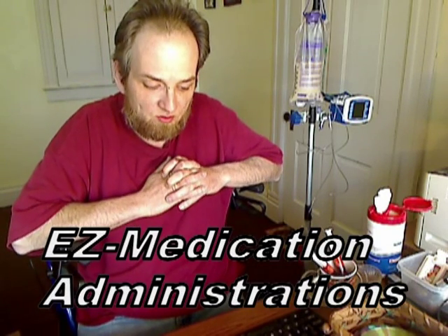Okay, everyone, I wanted to show you some feeding tube tips with medication. Of course, I can't swallow my medication, so all my medications are either liquid or they get crushed and turned into a liquid. I will show you in another video a neat way to crush your own medicines. If you take several, like I do, you can crush them in a coffee bean grinder, and it turns it into a fine dust, and you can add your liquid, your water, your juice, your coffee to make a liquid out of your medicines so you can use them in the feeding tube.